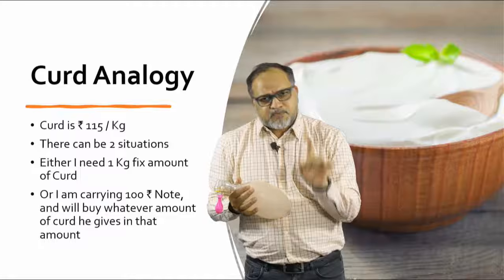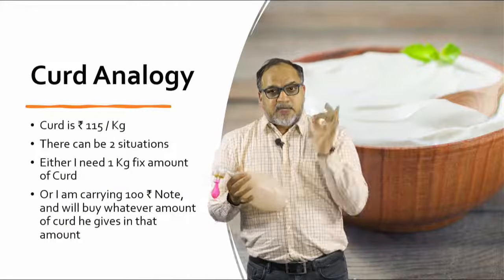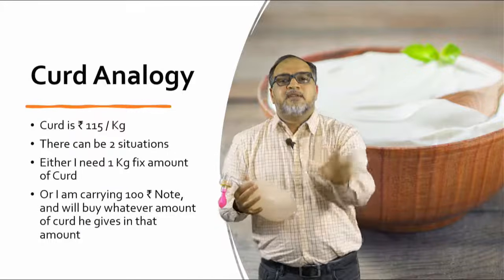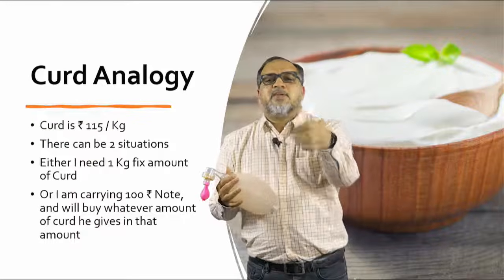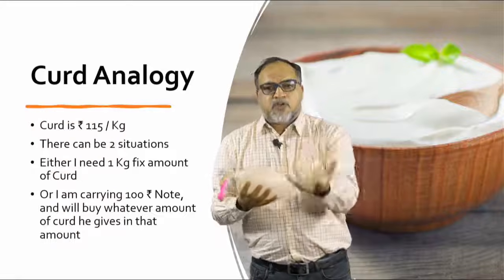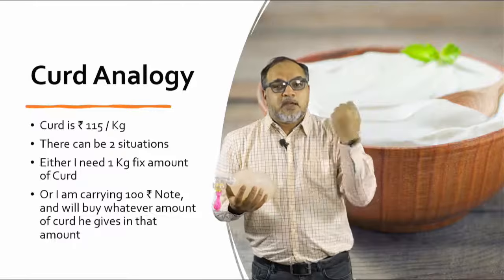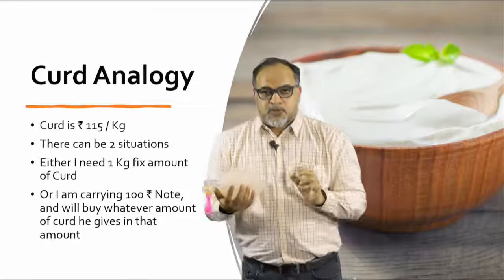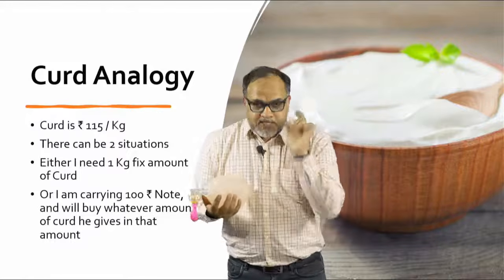Are you getting this? The same analogy applies in the ventilator. Either you can decide that I will not let the pressure go above 30, whatever the tidal volume be. Like in case of children, you cannot let the pressure go beyond 20, 25, 30. Or in case of volume control, you can decide that no, I have to give 500 ml of tidal volume irrespective of whatever pressures are generated. Then it is volume control. So either you control volume or you control pressure.